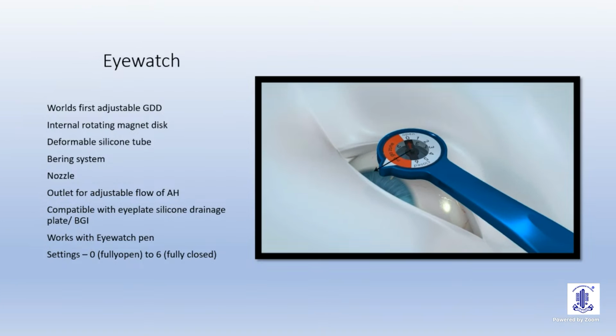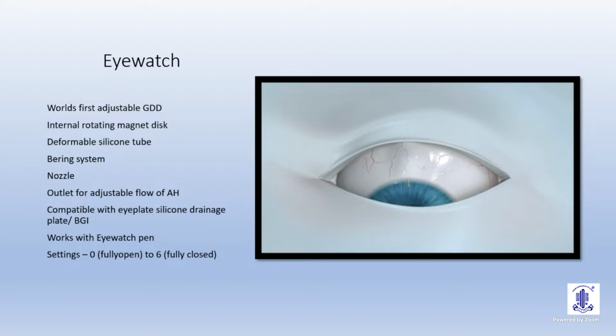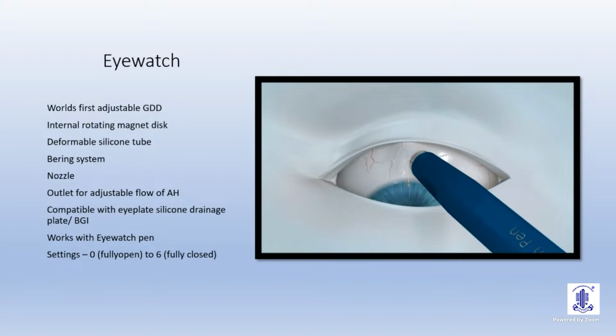Make sure to align the pointer of the compass with the implant's nozzle. The reading on the compass shows the current position of the implant. Positions range from 0, implant fully open, to 6, implant fully closed. To adjust the implant, place the magnet at the periphery of the implant at the position indicated by the compass and drag the magnet along the circumference of the implant to the desired position.